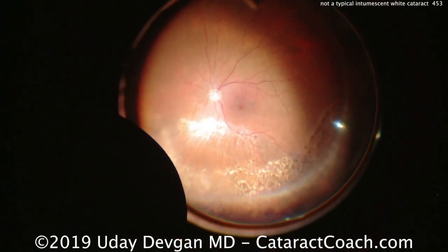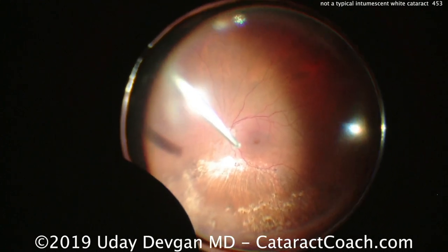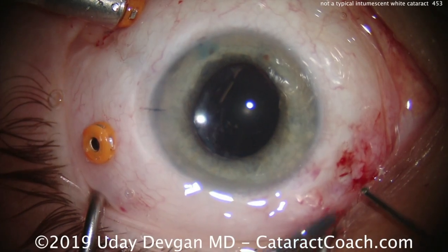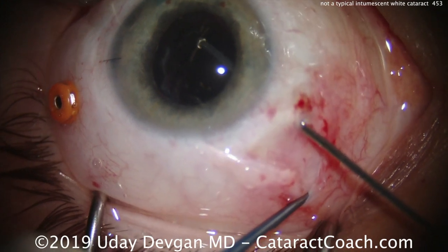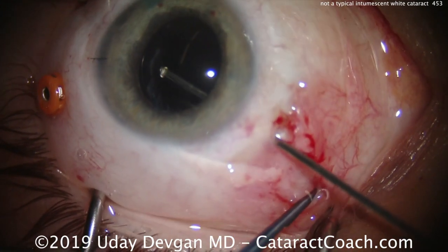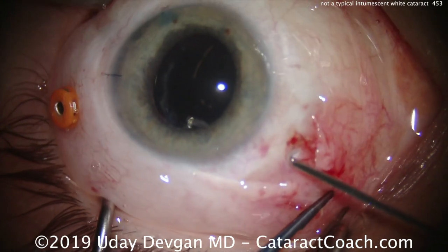And so all these things are giveaway signs that the patient's going to have a very complicated course intraoperatively and you should prepare to do the vitrectomy like this. And I'm happy to say the patient did well and achieved a very nice outcome. Happy to open this up for discussion. Here's the very last end, cleaning up a little bit of those capsule fragments to make sure it's nice and clean.